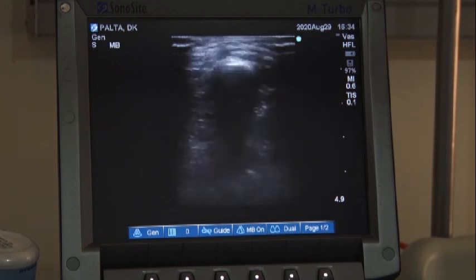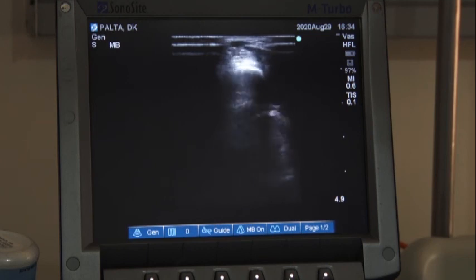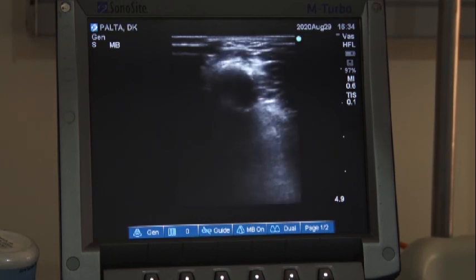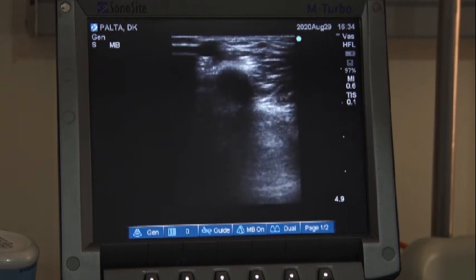But now if there is a problem with flow, if there is suction during dialysis, flow issues, it's not sustaining a blood flow, QB, of 300 or more, in that case we can ask for ligation of this accessory vein. Yes, we can do that. Because it's very superficial, we can do percutaneous ultrasound-guided ligation also. So he will be benefited if there are flow issues.